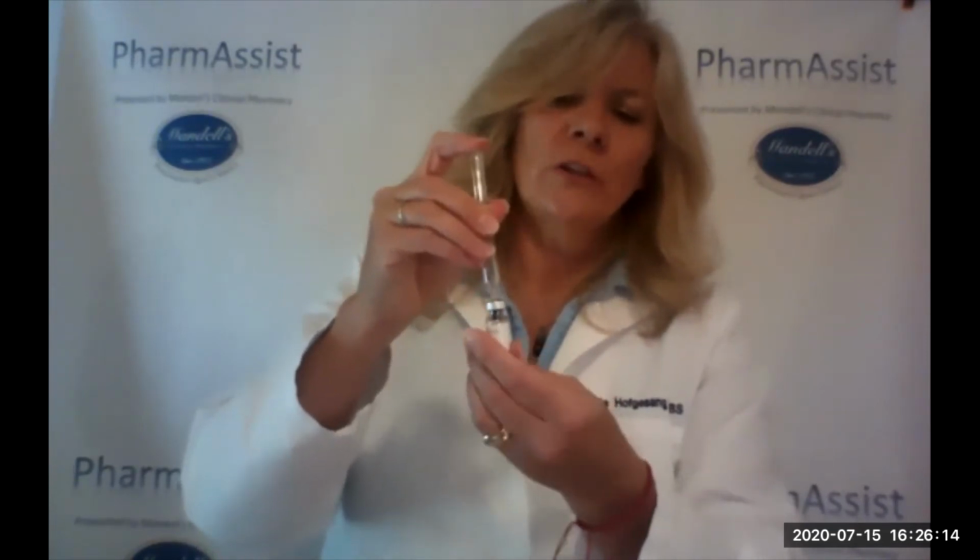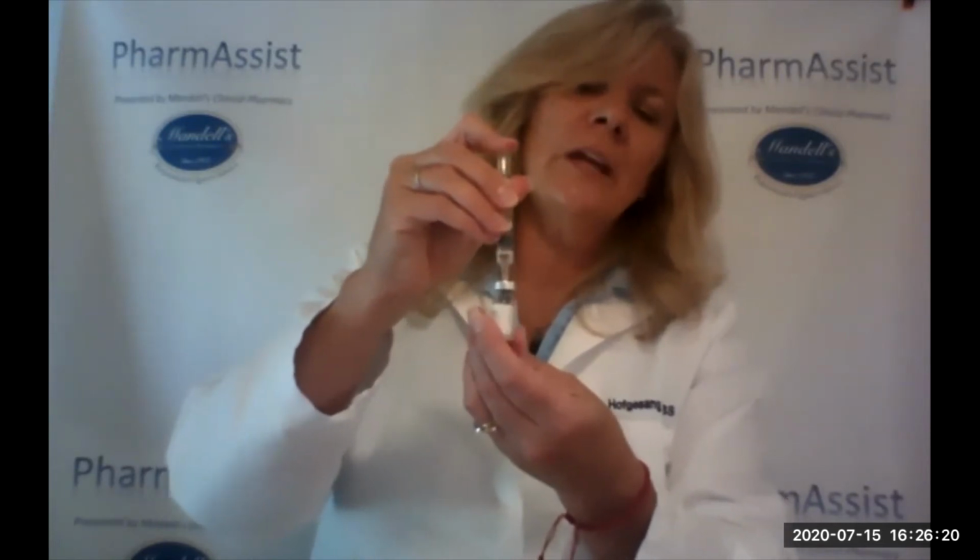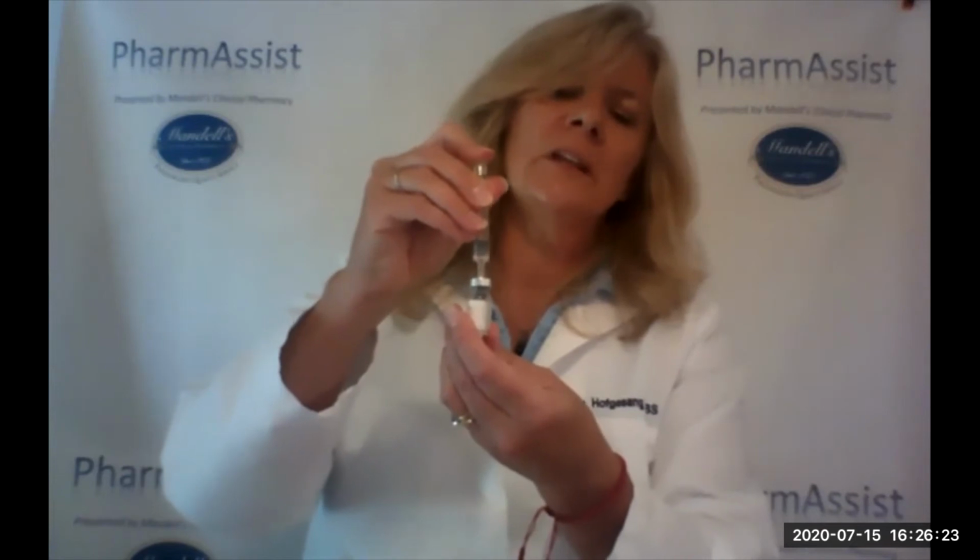Then our next step is to take the injection pre-filled sterile water and uncap that needle. And what you're going to do is poke that needle through the center of that vial where there's a rubber stopper, and you're going to gently push the solution of that water, and do it gently, because the vial will have little bits of bubbles. It may actually, with that powder in there, be a little cloudy at first, but what you want to know is it's going to clear up.